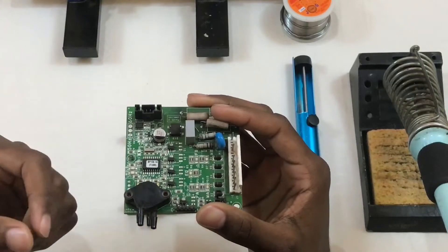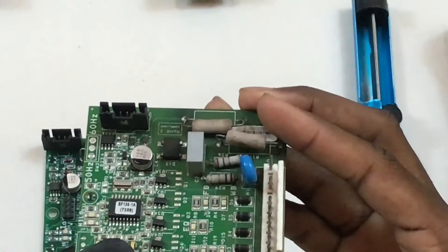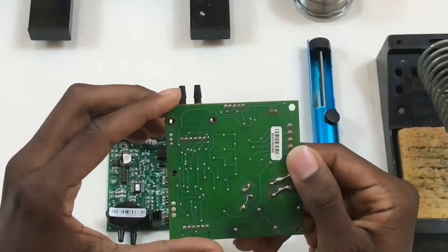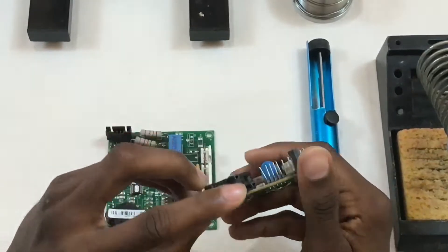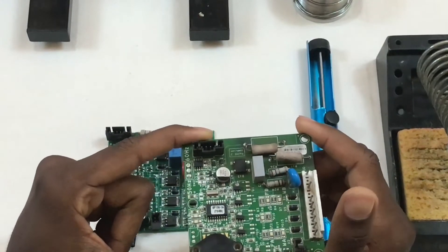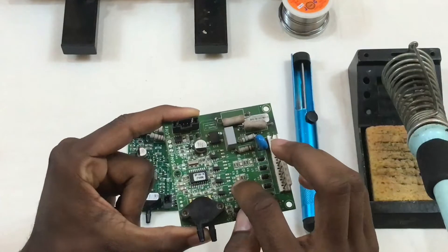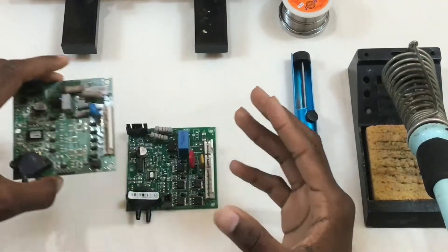In the second generation, AirSafe moved from through-hole mounting technology to surface mounting technology, so most of the components here are surface mount and only the power supply components are through-hole. Looking at the bottom of the board, it's much smoother and cleaner than the first generation. On this board there are also LEDs that correspond to the solenoid valves on the oxygen concentrator, and these LEDs are also surface mount, just like most of the components on the board.